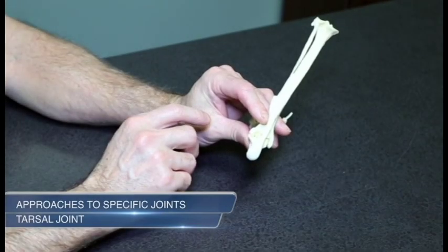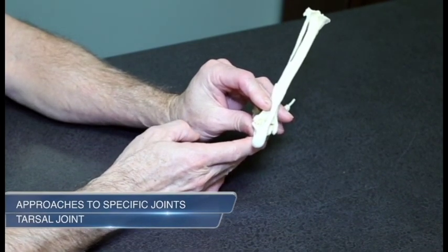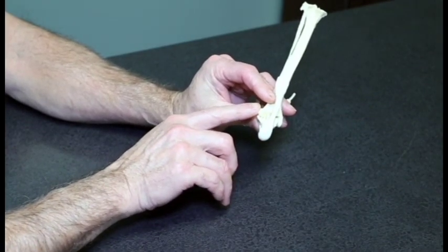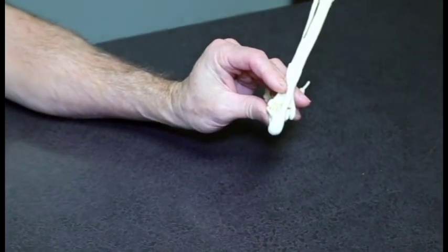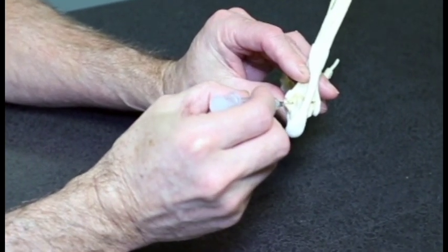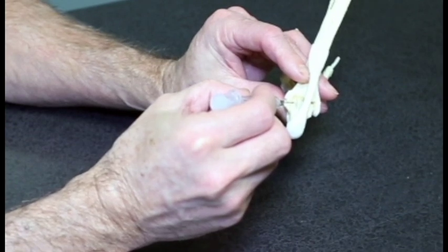Tarsal joint. Fully flex the joint and palpate the small gap between the medial aspect of the lateral malleolus of the fibula and the distal tibia. Position the needle parallel to the calcaneus and insert in a slightly medial direction. The joint is shallow, so the needle does not require advancement very far.